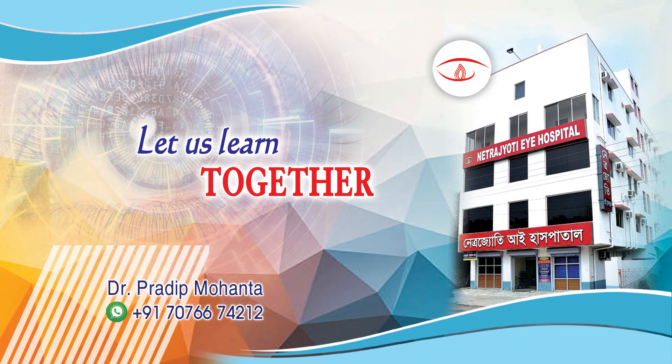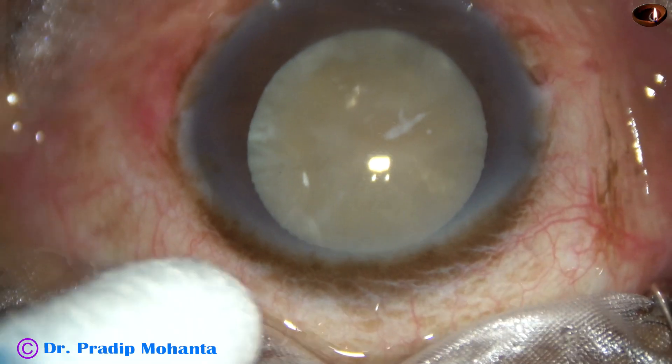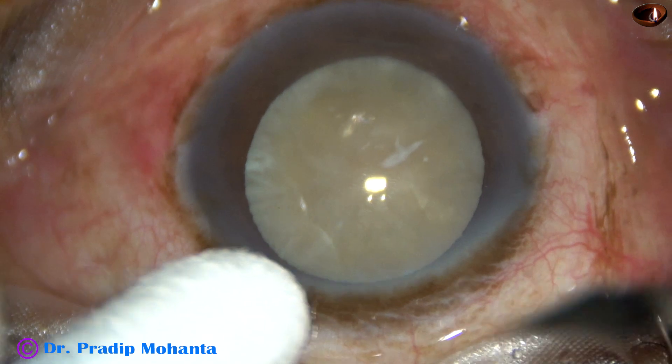Friends, welcome to my workplace at Ranaghat, West Bengal, India. This is a hypermature cataract. Let us observe the surgical management of this case.